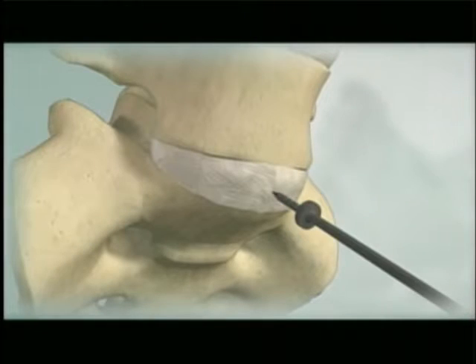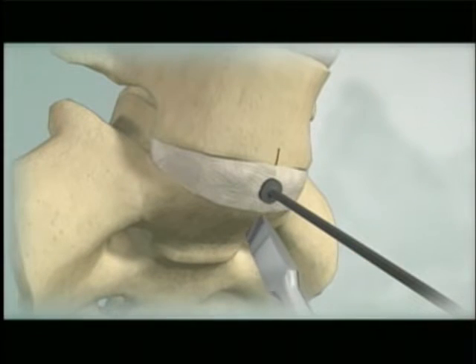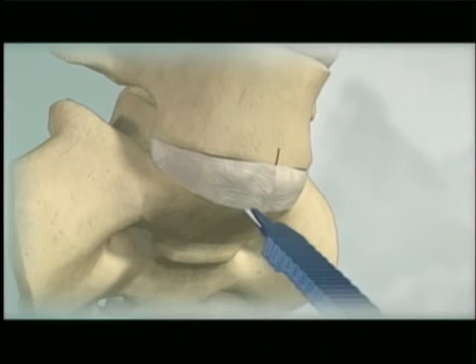Identify and mark midline on the superior and inferior vertebral bodies adjacent to the operative level. Create an annulotomy centered on midline, wide enough to accommodate the ProDisc L implant.